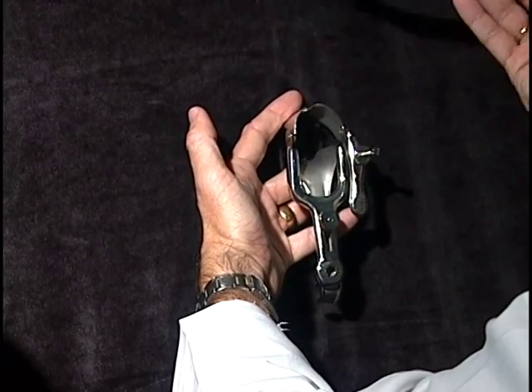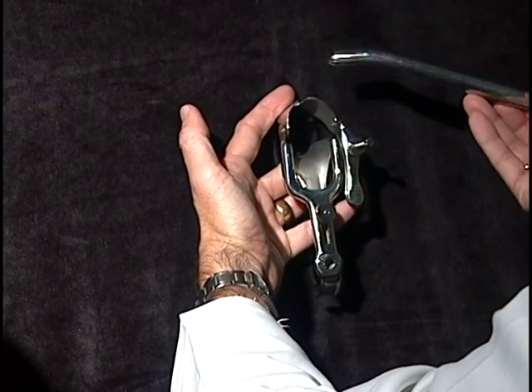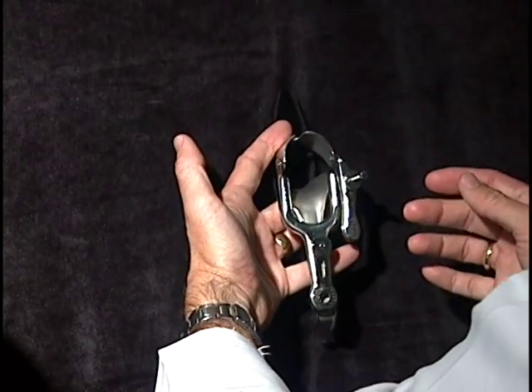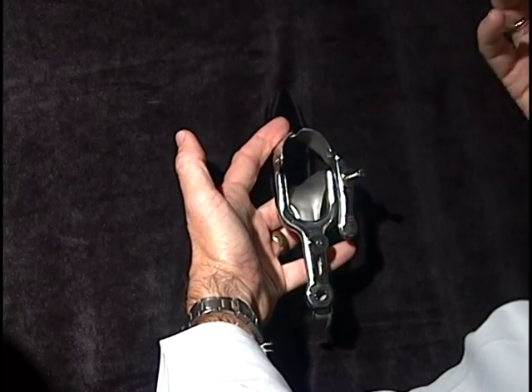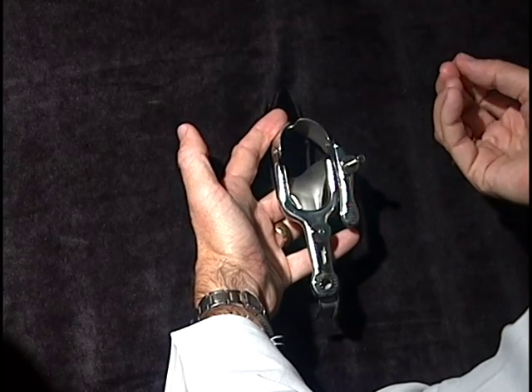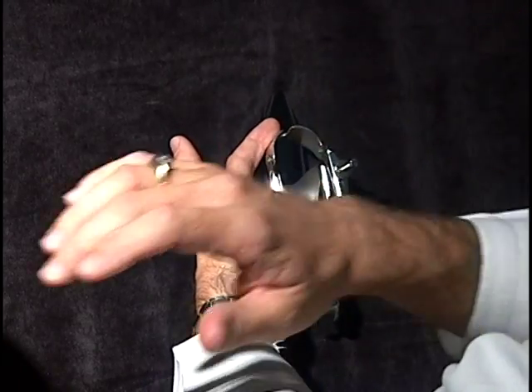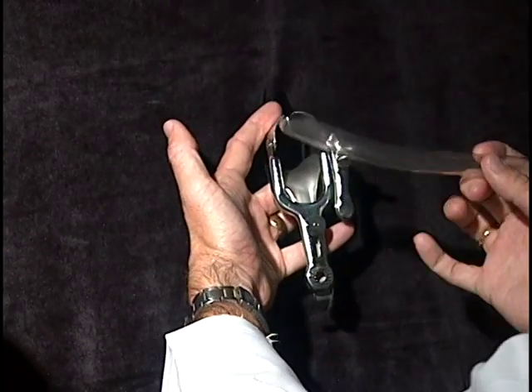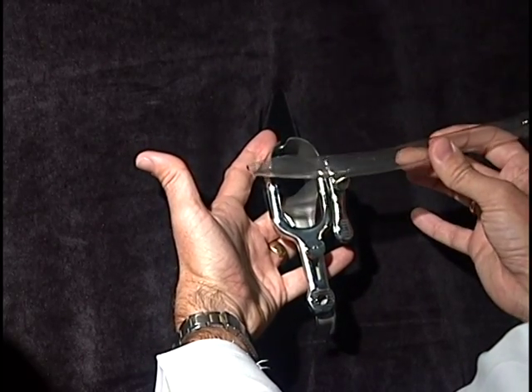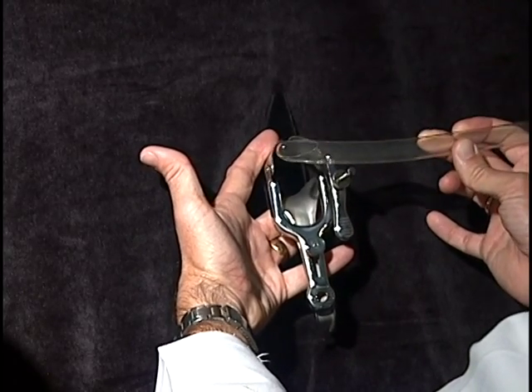Once the cervix has been opened, the womb is now accessible to the abortionist and the baby has lost its protection from the cervix. For the first trimester abortion, even though the baby has a heartbeat, fingers, toes, arms and legs, it's not developed enough to have real strong bones. So the baby, the placenta, and the fluid are all removed with a suction device. The suction tubing is hooked up to a suction curette like this — or even smaller depending on how far along the baby is.